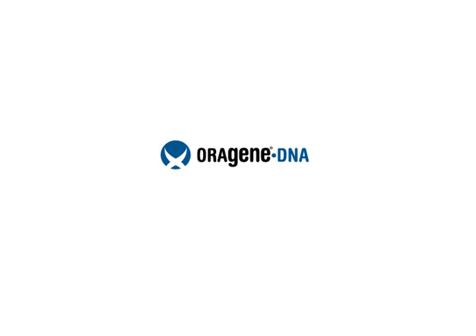Shake the capped tube for 5 seconds. Oragene DNA is easy to use, non-invasive, and ideal for the safe collection of DNA from saliva.